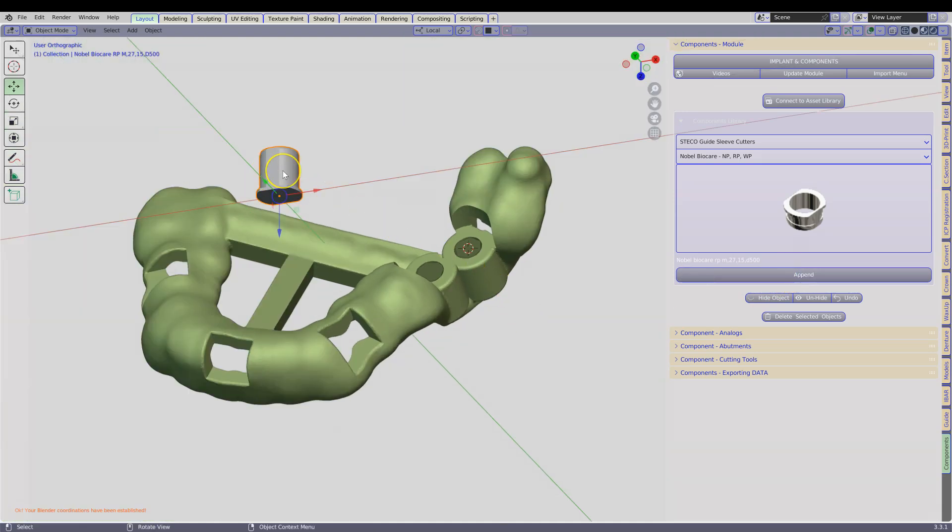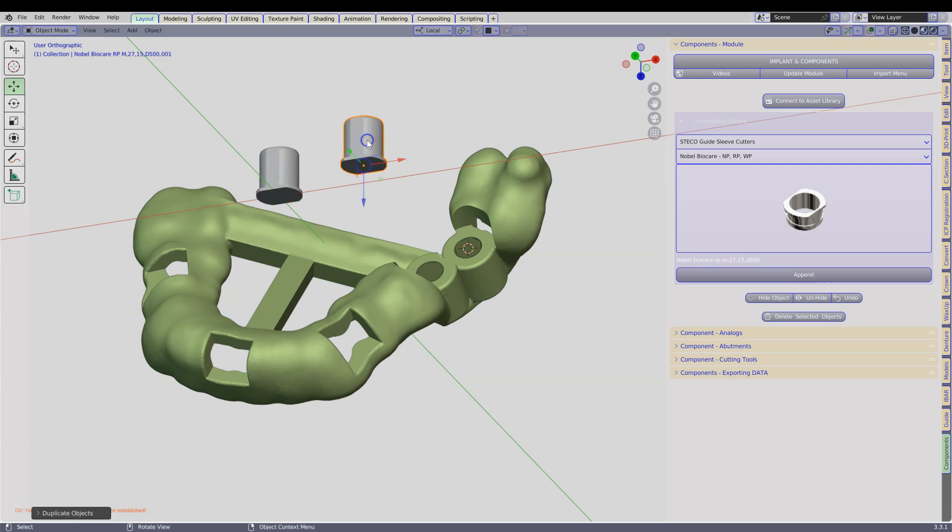Append that into the scene. We want two of these, so Shift D. Go back to the guide module.